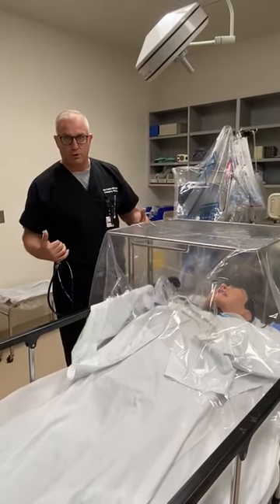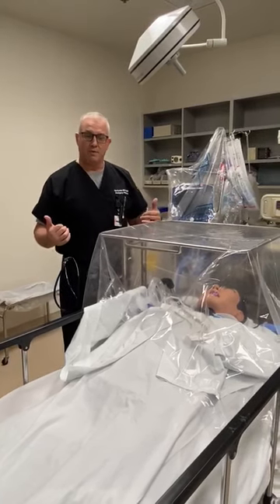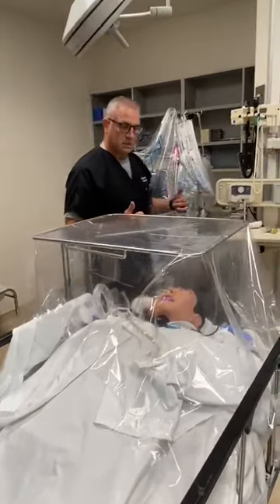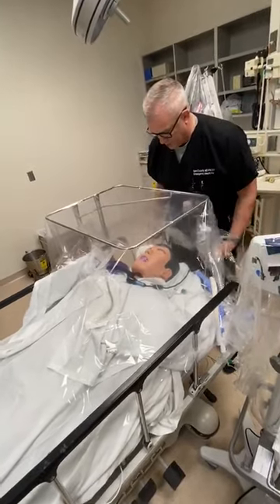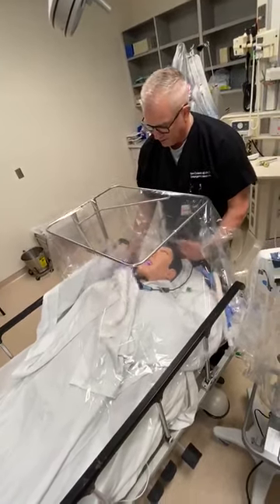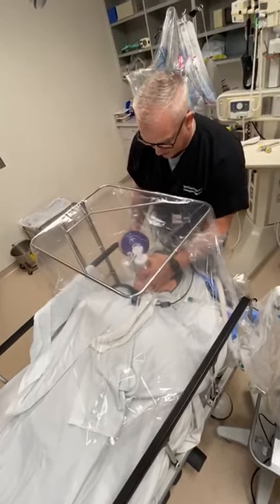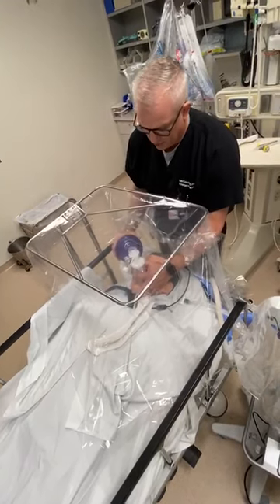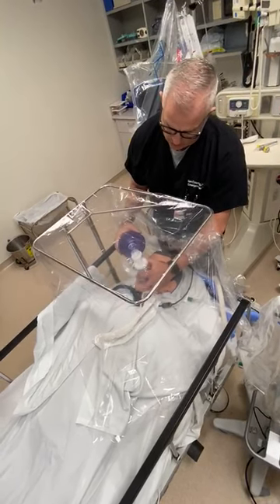Obviously the first thing you would do is put on your appropriate PPE gear — since we're trying to conserve that these days, I'm not putting that on right now. So the process is basically: you get to the head of the bed, you get your arms underneath, and you just let the material drape down in front of you. You've got an oral airway in and you just bag mask the patient like this, and the tenting device will help keep all of that particular matter that's being expired down here.